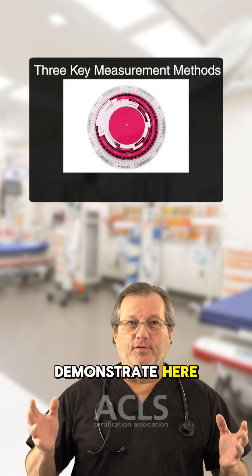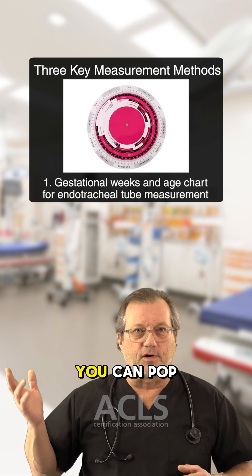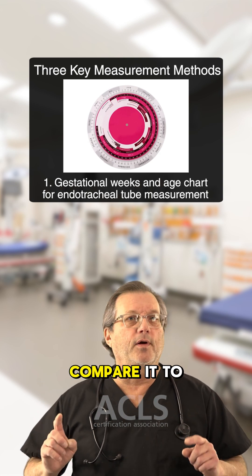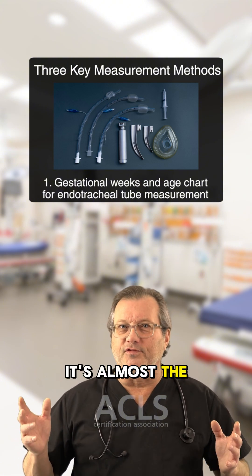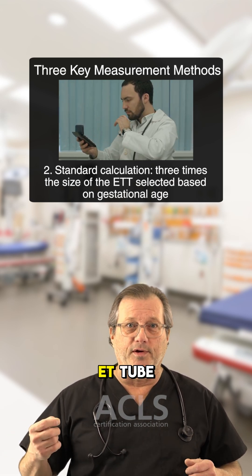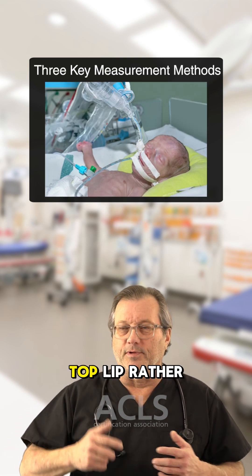There are three methods demonstrated here. One is using the gestational weeks and age — there's a chart you can pop up and have in your OB kit. If you look at this chart and compare it to the ET tube sizes for those gestational ages, it's almost a standard three times the ET tube size. So if you pull out a 3.0 ET tube — three, six, nine — you're going to be somewhere around nine at the top lip.